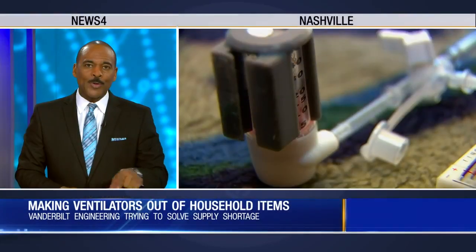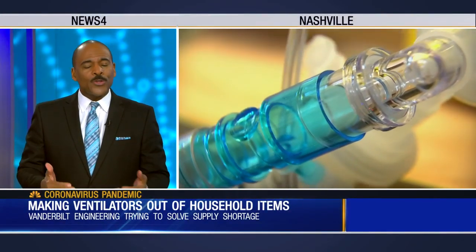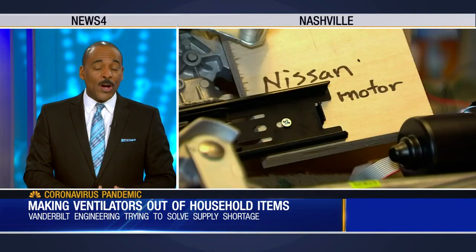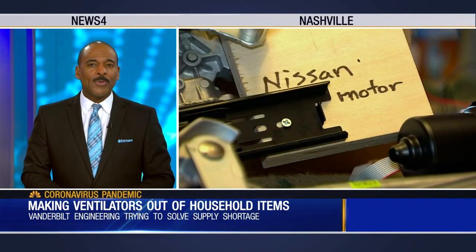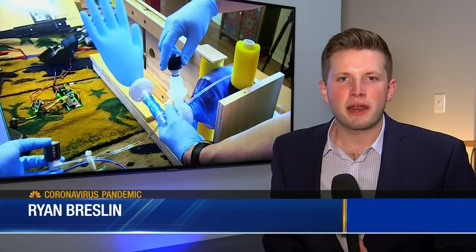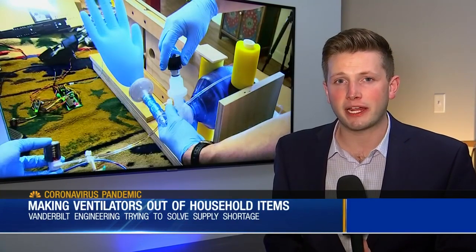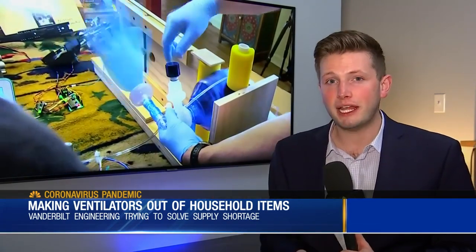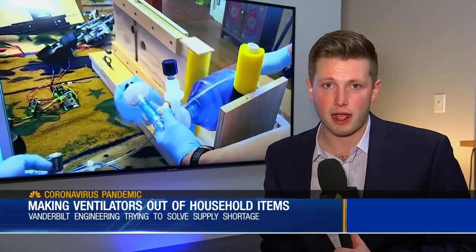Back to our COVID-19 coverage right now. We're hearing so much about the shortage of ventilators in our country. Engineers at Vanderbilt are working on an alternative. News 4's Ryan Breslin shows us how it will work. Without a ventilator, a medical professional needs to pump air by hand into a patient to help them breathe. This is the machine they are hoping to replace that with if ventilators run out.